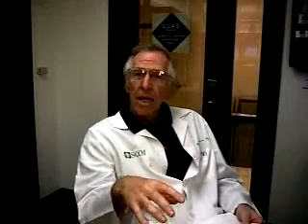Okay, what we'd like to do is go over some concepts involving partial knee replacement compared to a total knee replacement. We're going to start out by going over the concept that in a total knee, all the compartments of your knee are arthritic and have damage. So the medial, the lateral, and the kneecap are all damaged.